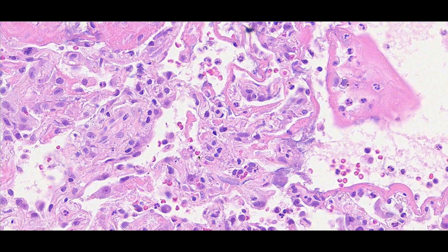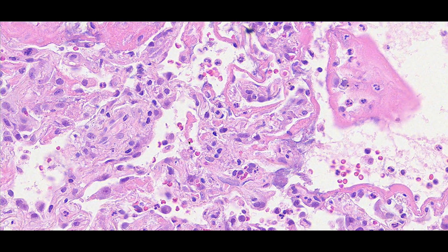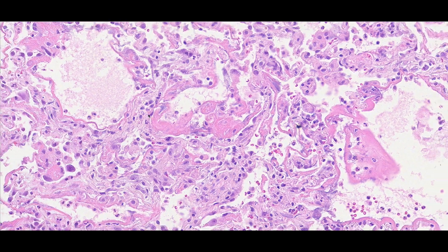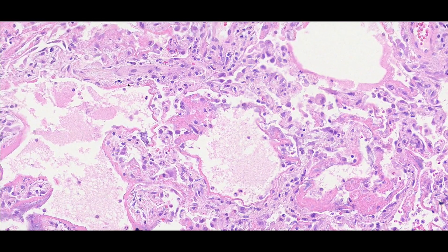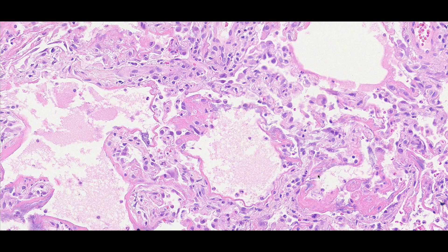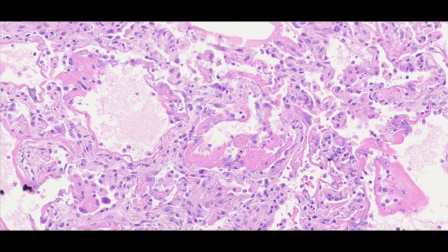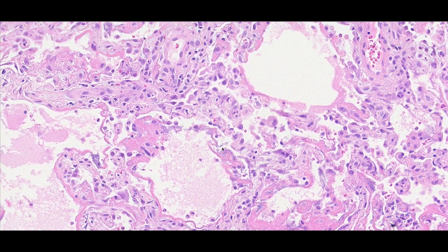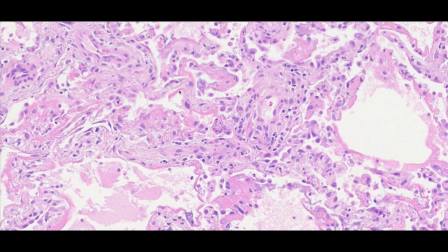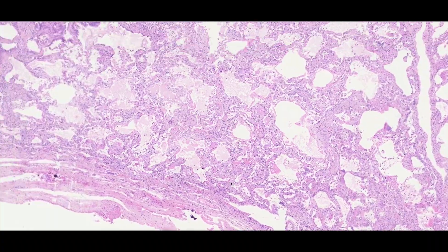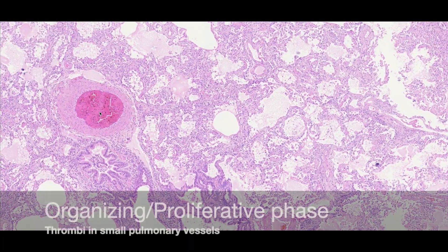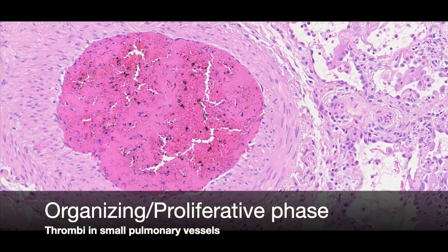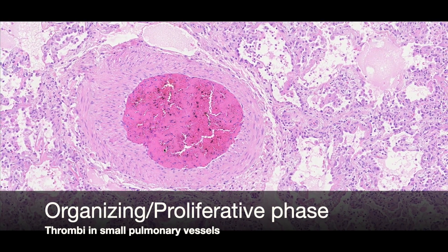As we get into the organizing phase, the hyaline membranes start to resolve. If you get a biopsy at this stage, they may only be focally present and you really have to hunt for them to make the diagnosis. As the lung heals, it will continuously evolve and we'll start to see some areas of squamous metaplasia. This case also has another finding — organizing fibrinous thrombi within a vessel — which can be seen in the later stages of diffuse alveolar damage.